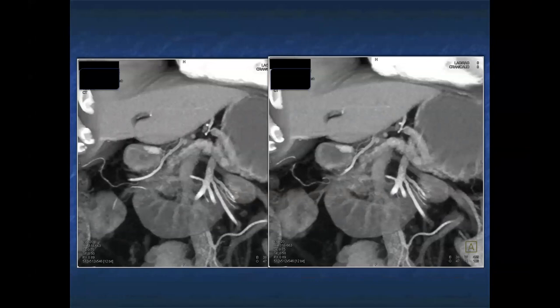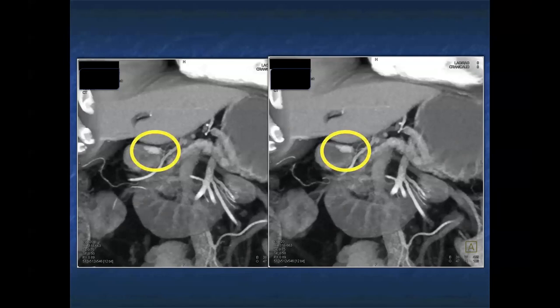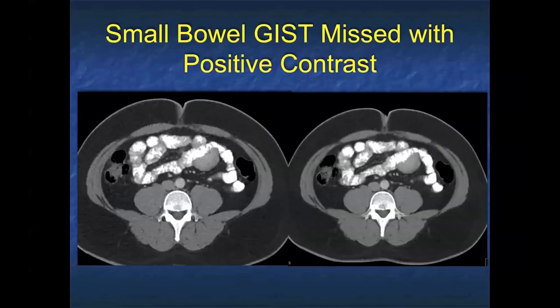You can also see the vascularity of lesions. Carcinoids and neuroendocrine tumors are typically vascular, while things like adenocarcinoma and lymphoma are typically hypovascular.